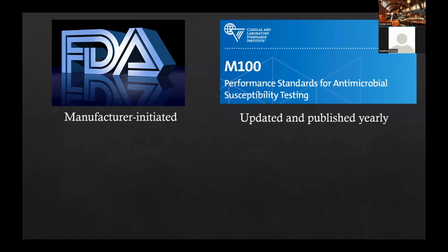Like I said, CLSI is an independent organization, a bunch of microbiology and pharmacy experts who get together a few times a year, and they look at data that comes from manufacturers, from research labs, and from their own clinical laboratories, and they decide what the breakpoints should be. So you can imagine that sometimes the breakpoints at CLSI are different from those that are set by the FDA, which always causes us a big headache.